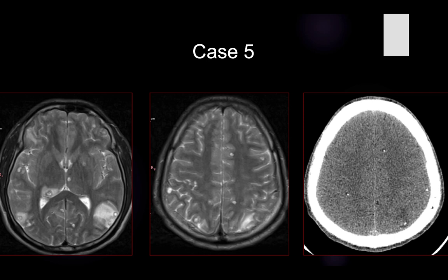You can clearly say this is neurocysticercosis once you see multiple cystic lesions with a small dot inside. This is characteristic of neurocysticercosis, and as shown here in the images, neurocysticercosis involves multiple locations. It can involve the thalamus, the basal ganglia, the white matter, the ventricular system, and also the extraaxial spaces. It can involve any place from the intraventricular to the extraaxial systems. So this is the typical example of neurocysticercosis. Once you see a cystic lesion with a small dot sign, this is typical of neurocysticercosis.